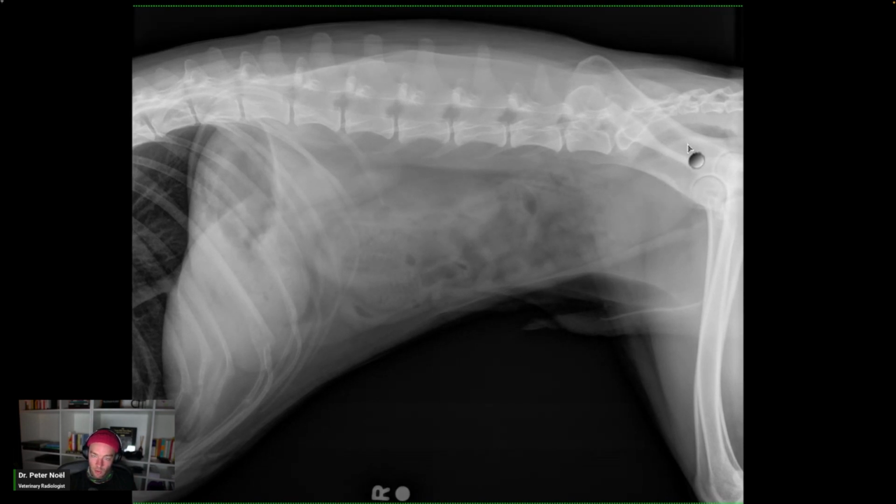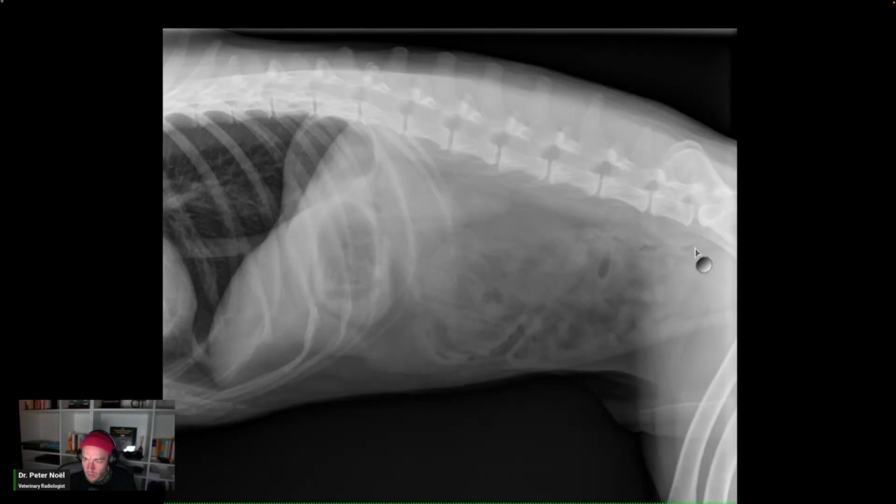The next thing I do is the colon. I go, where's the colon? Gas, empty, empty, empty. I don't know. I lose it, I'm not going to lie. Okay, next thing I do is the stomach, because the small intestine I think is the hardest thing. So this is the stomach.